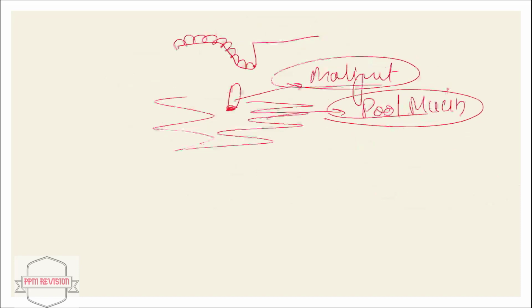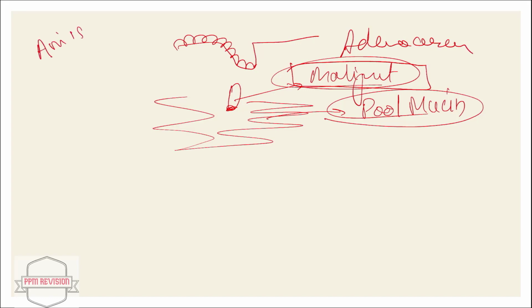So now looking at adenocarcinoma, we'll be looking at a few points. That is nothing but the presence of malignant tumor cells as well as pool of mucin. Just giving a few points of adenocarcinoma. In case of adenocarcinoma, there is proliferating glandular acini lined by darkly stained columnar cells in one or many layers, showing anisocytosis, anisonucleosis, and mitosis.